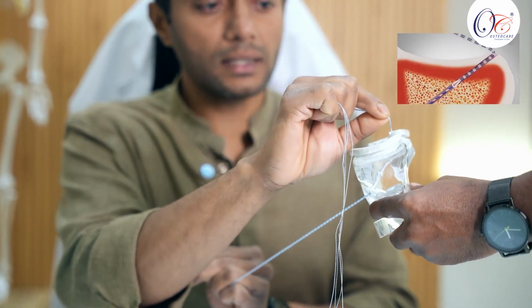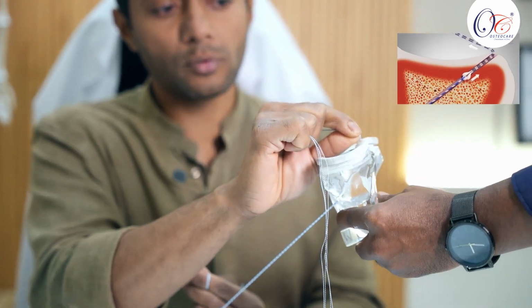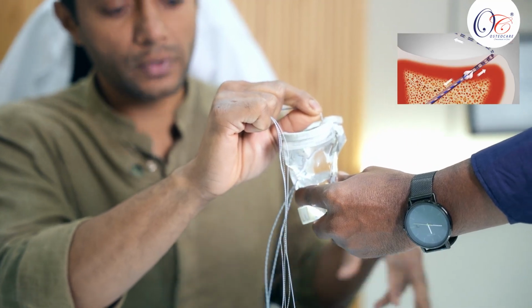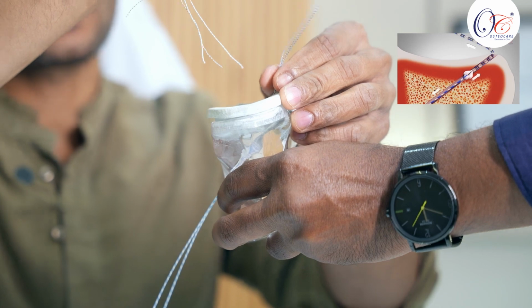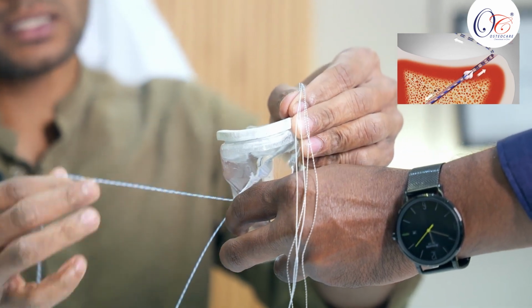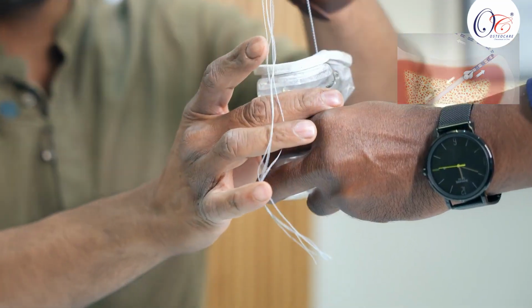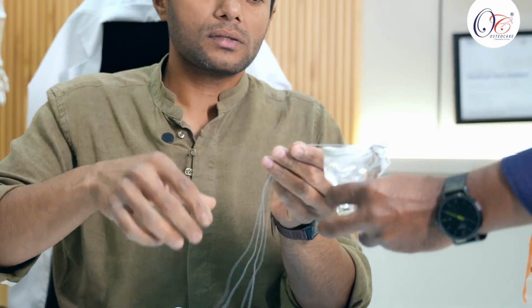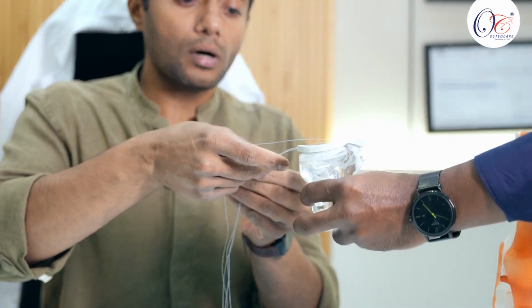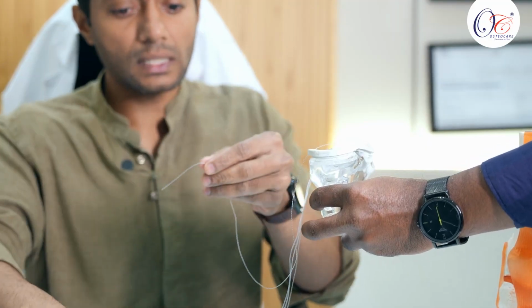So once the anchor enters just below the tibial subchondral bone for about 15 mm to 20 mm inside, it is deployed. Once it is deployed, it cannot come this way and these pulling sutures can be completely removed. So now we are here with the anchor deployed and the suture material. So we try to use a cannula to alternately put these sutures into the meniscal root tear.